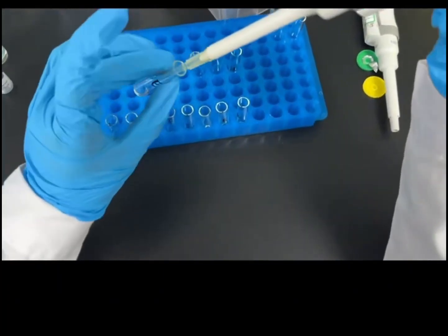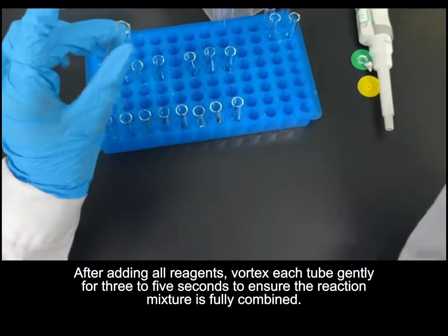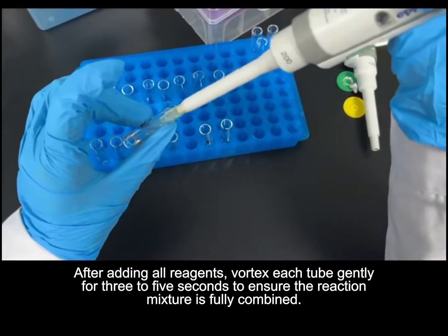During incubation, the tubes must remain completely undisturbed. Avoid vibration or movement to ensure proper gel clot formation.